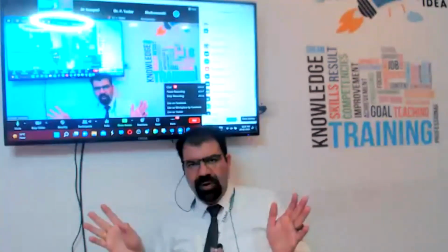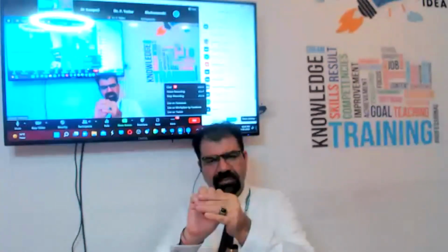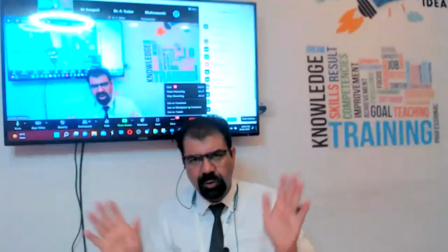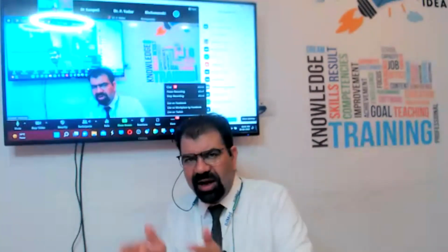Otherwise, whatever volume will come will not be the actual volume of that thing. What are the three measurements? Length, width, and depth. This is a detailed class in physics and machine settings, how to take a volume. Now, apply this on the uterus and tell me how to take a volume of endometrium.